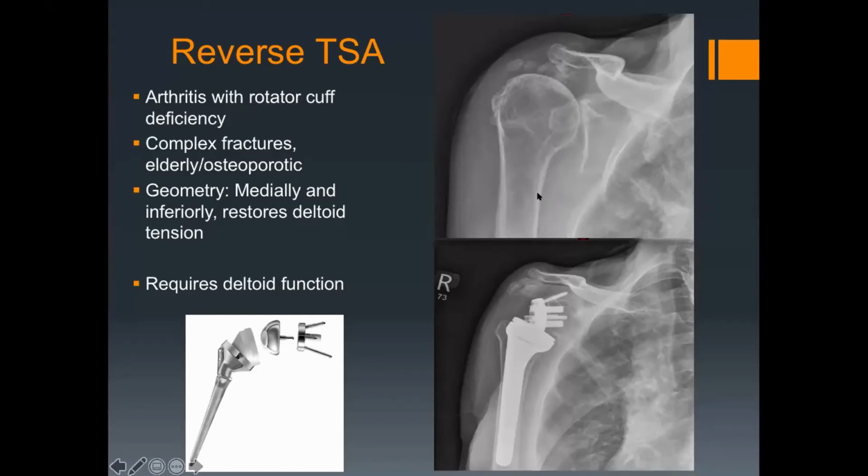You can see there's evidence of a clear rotator cuff arthropathy, with cranial migration of the humerus, fragmentation of the undersurface of the acromion and some secondary degenerative changes in the shoulder joint. This is implantation of a reverse total shoulder arthroplasty. The humeral cup articulates with the glenosphere, and the glenosphere should be put in at neutral version and inclination.